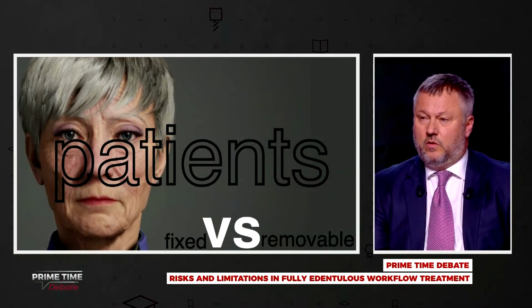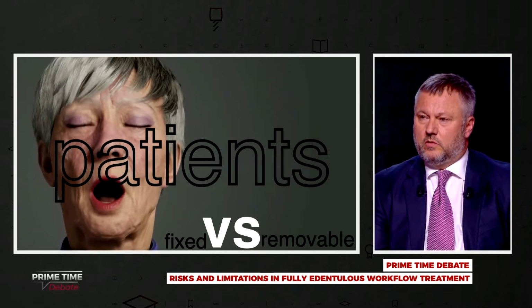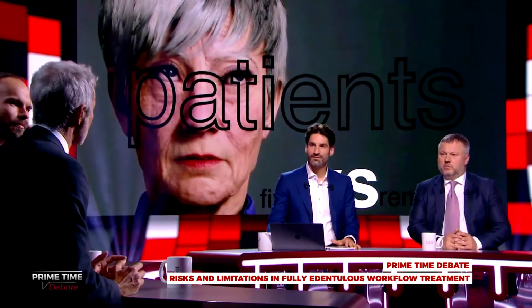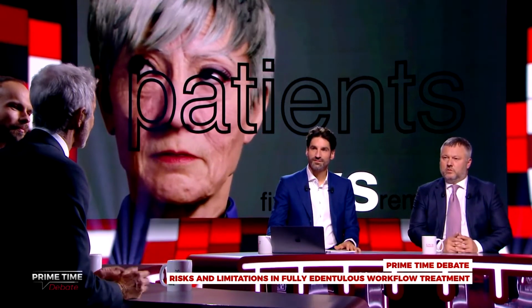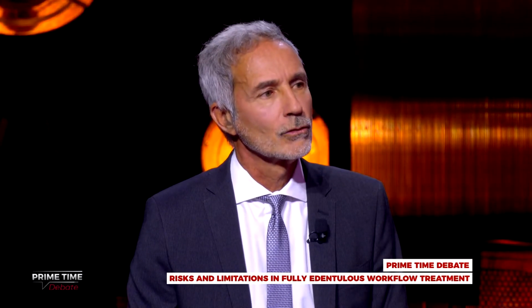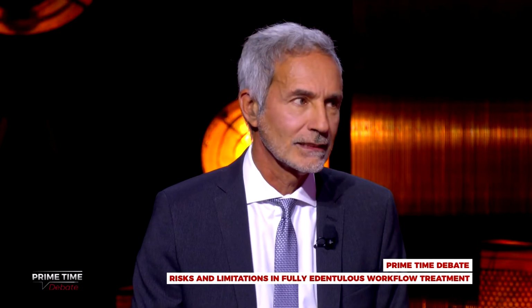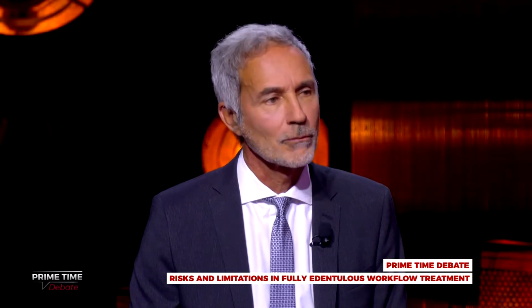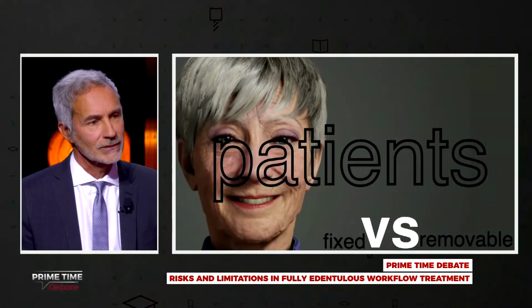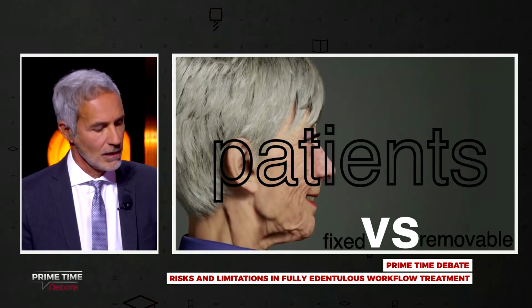Yes, because it is mandatory to plan. Each patient is different from the other, with their own expectations, their own needs, their own requests, and their own facial expression, as we can see in this video. And so we have to avoid the standardization of the treatment and decide when a fixed or removable treatment is required, and you must be on the safe side and choose what is appropriate for that specific patient.